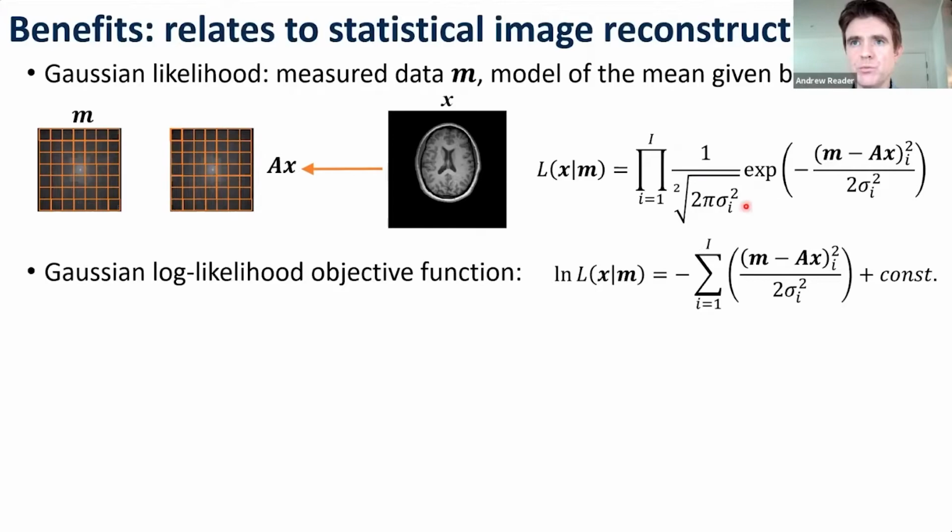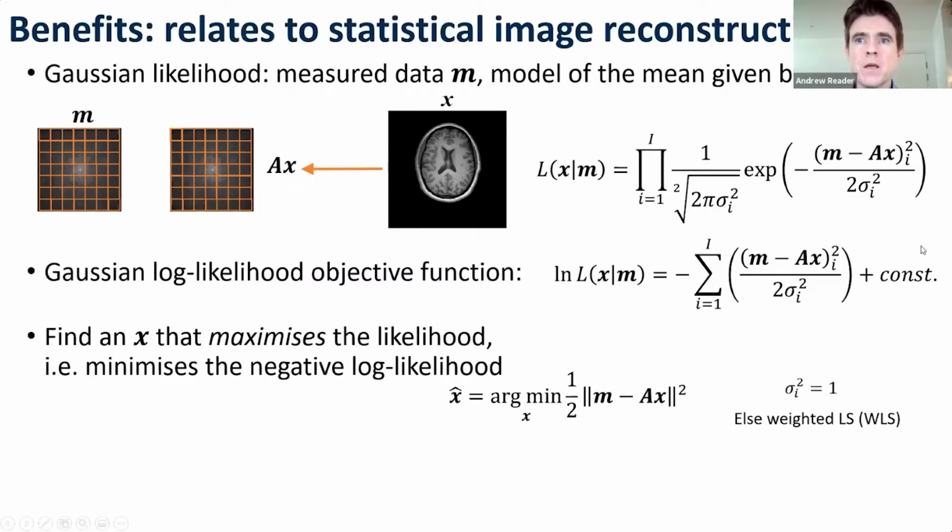So we take the natural logarithm of this Gaussian likelihood to get rid of that exponential. The product now goes to a summation and the exponential disappears. That shows where we're headed, which is the least squares here. And then I've taken this out as a constant, assuming constant variance in that Gaussian.